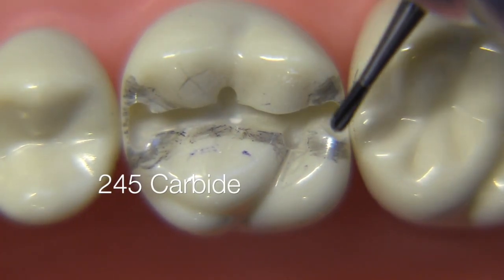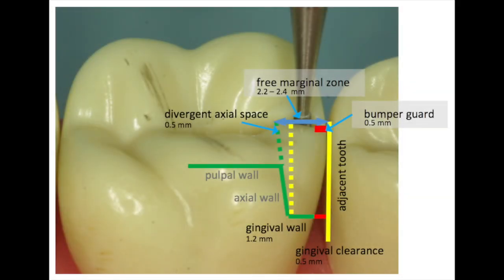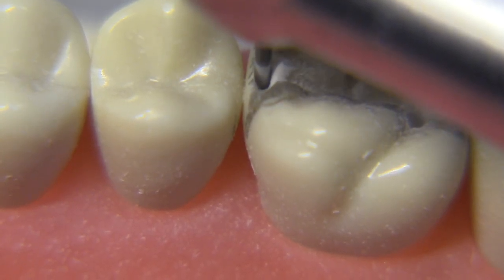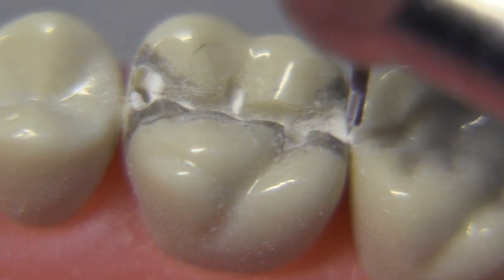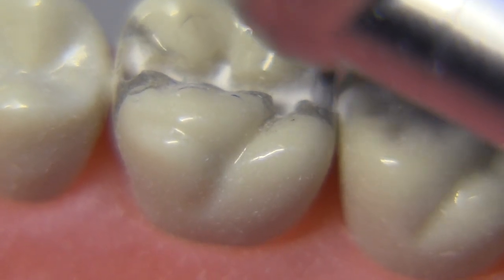Let's get started with dropping the proximal boxes, for which we're going to use the 245 carbide bur. You have to remember there's a lot of wiggle room for dropping the bur — you can go significantly far down the preparation towards the gingival without being too fearful, and you can keep the bur significantly further away from the adjacent tooth than maybe you thought, because the bur is only 0.8 millimeters. Always look at the tooth from the side to achieve the appropriate amount of gingival clearance, which is usually 0.5 millimeters or a little bit more.